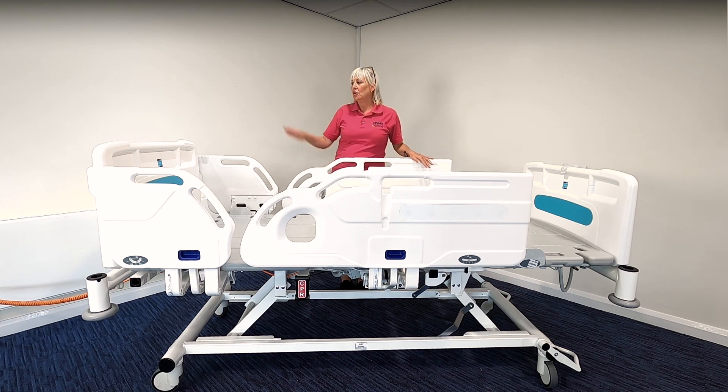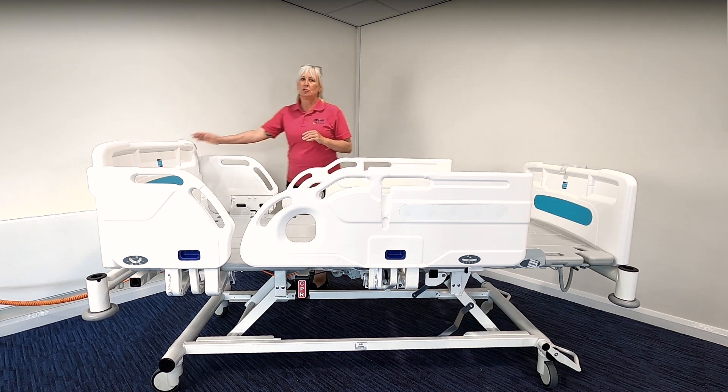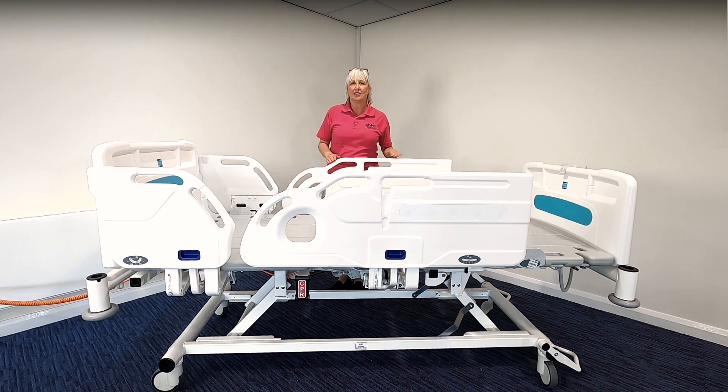Finally, when moving and transporting the bed, ensure all obstacles are removed from the bed space area, unplug from the wall, and store the plug and lead in the cable tidy provided. Ensure the platform is at a suitable height, and always make sure that when you move or transport the bed you use the footboard or the headboard to move — and never use the side rails.